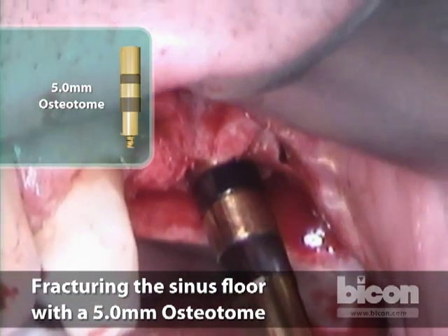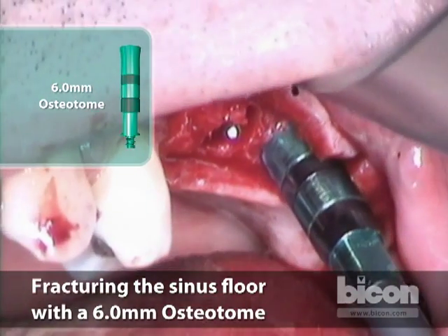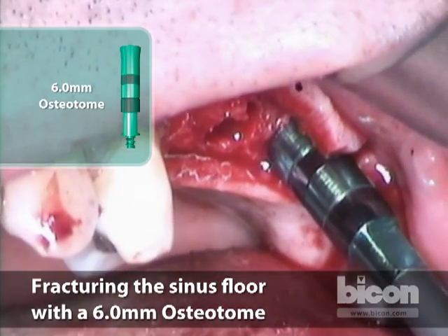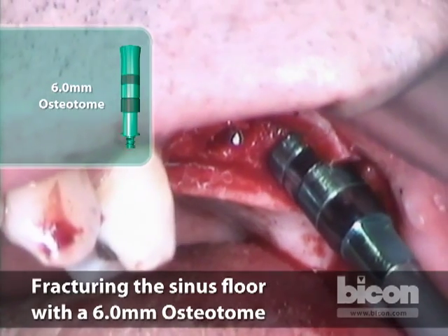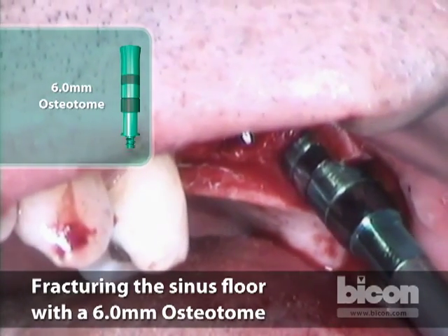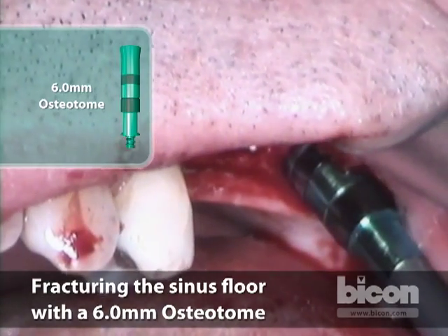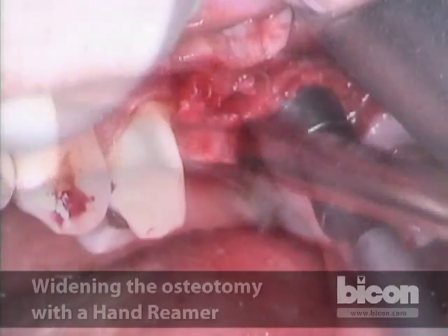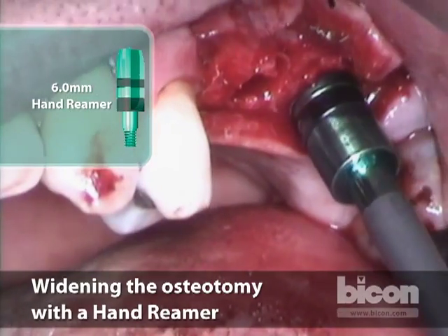We take it out and switch to the wider osteotome, which is the six millimeter. What will happen is the back slope of this one is going to be tighter, but I think it will give a little bit faster. The back slope needs to be thinned out.